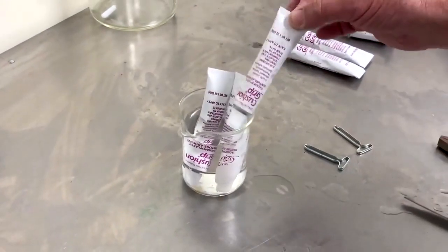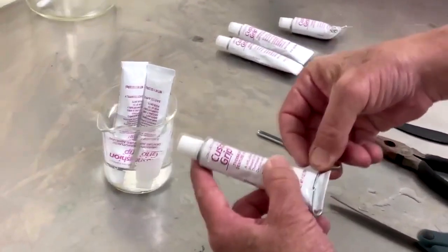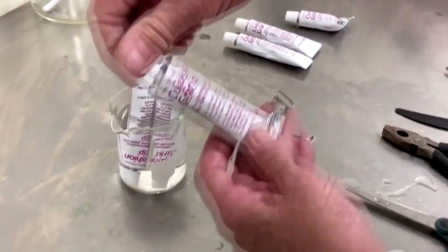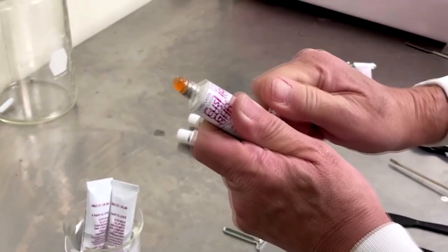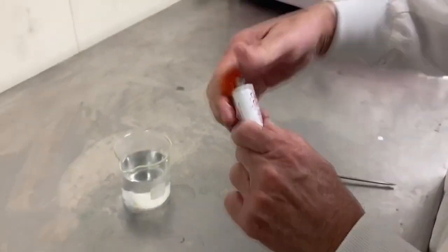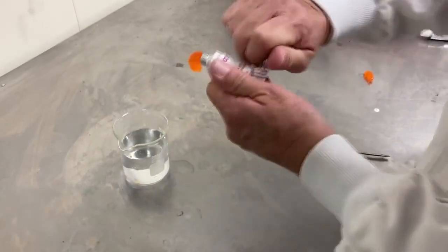After you remove the tube from the hot water, you want to apply the key that is supplied with the product and rotate it along this. You want to remove the cap and rotate the key until the cushion grip starts coming out of the tube. You can see that it comes out quite easily with just the key itself.